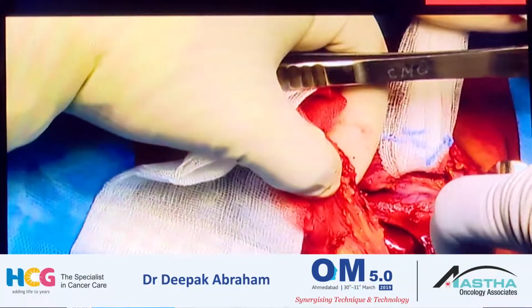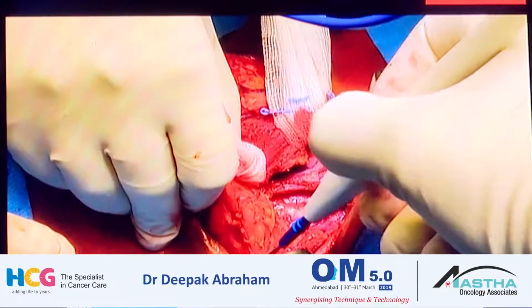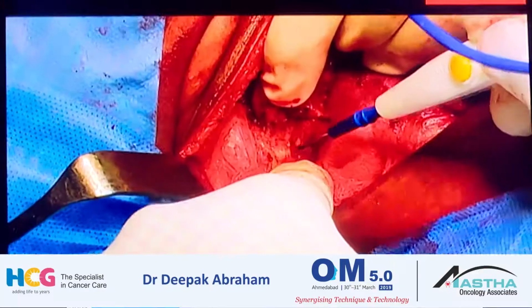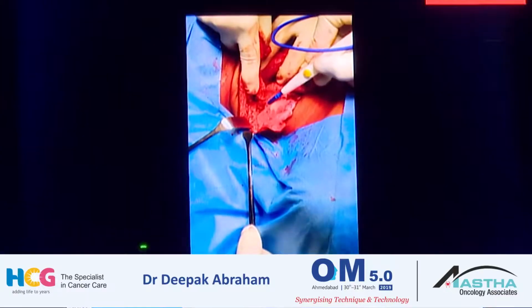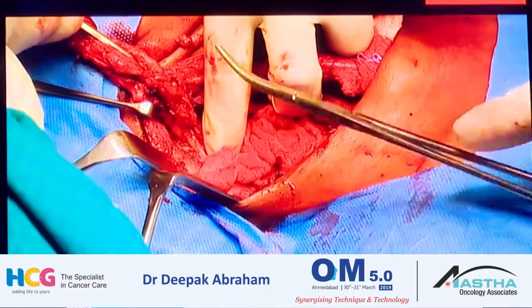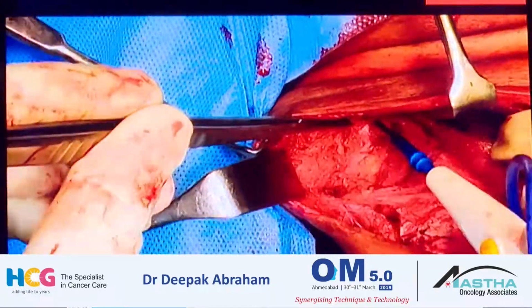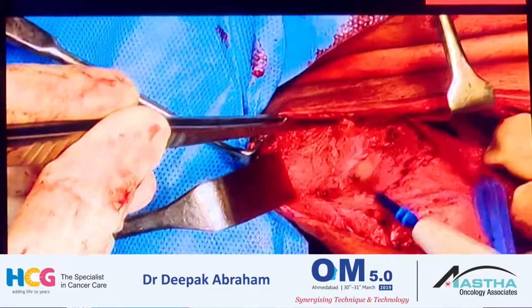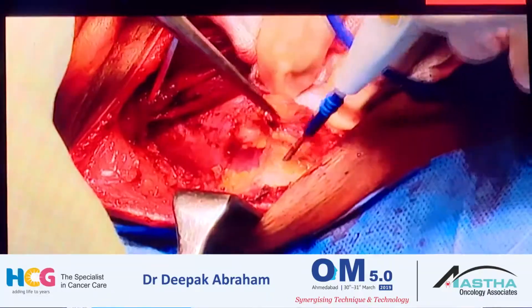And we just use a ligature vessel sealing device to take off the nodes from level 3, 4, and then move on to 5B. So you can see the twitch there which happened in the sternocleidomastoid and the trapezius, and then you know that's where your accessory nerve is, and there's a dissection which shows there. And we don't go above the accessory nerve if there are no nodes. You stay below the accessory nerve for that part of the dissection.